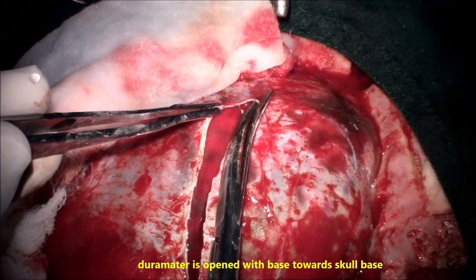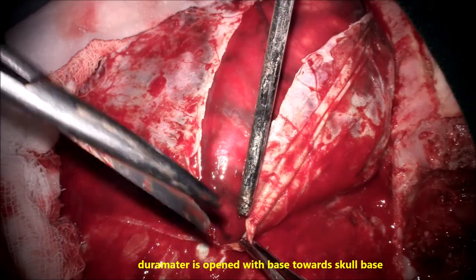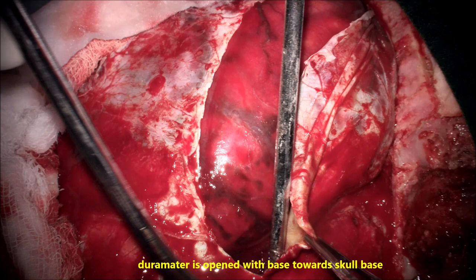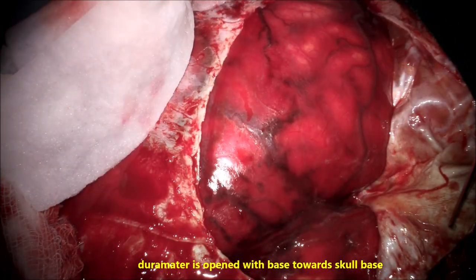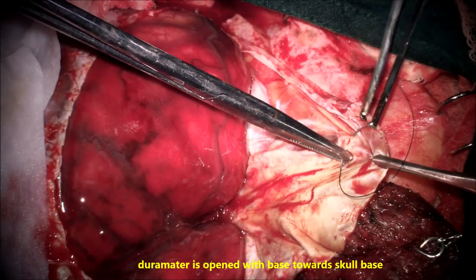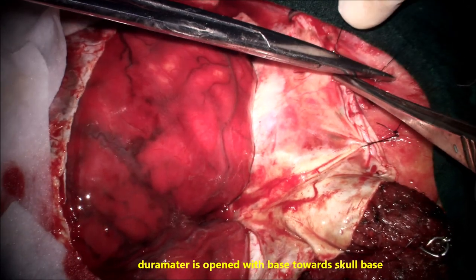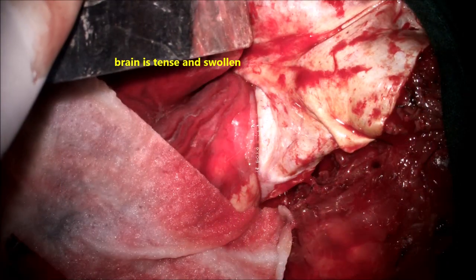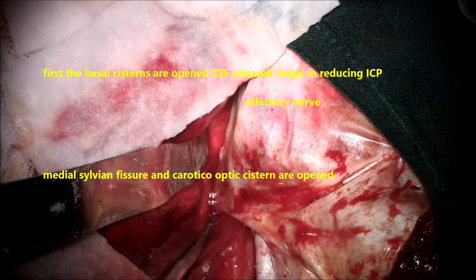One must spend time drilling this. The dura is opened with the base towards the skull base. The brain surface is diffusely swollen but not hemorrhagic — it is red and swollen and appears slightly angry. The dura is stitched edge-on to the temporalis muscle as tightly as possible so it doesn't come in the way during surgery. Since the brain is tight, we need to retract the temporal lobe gently.